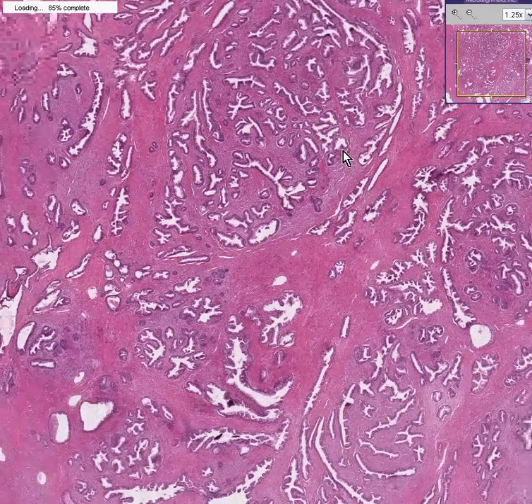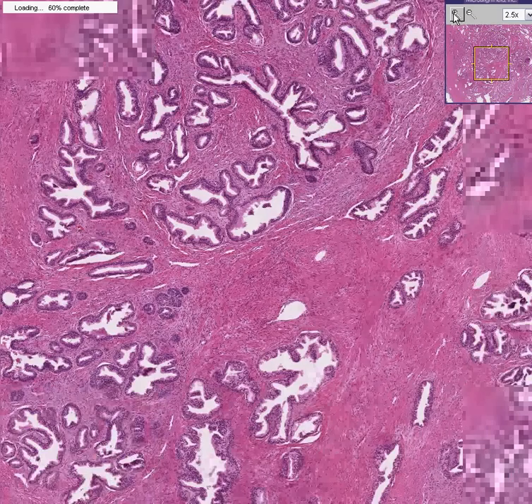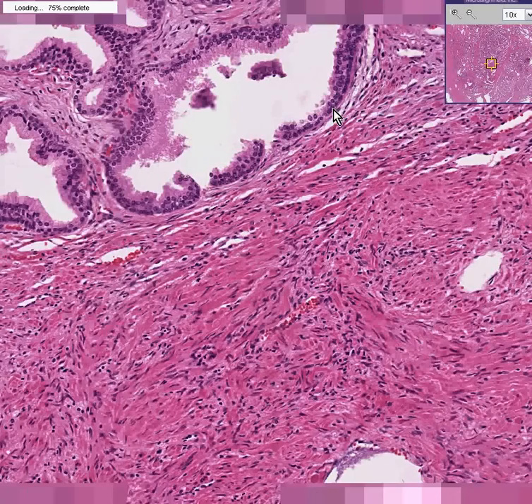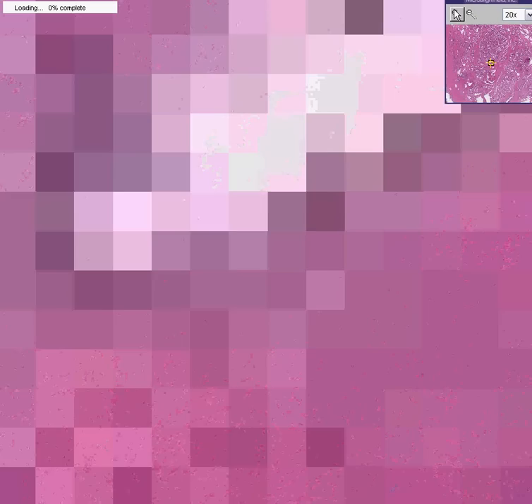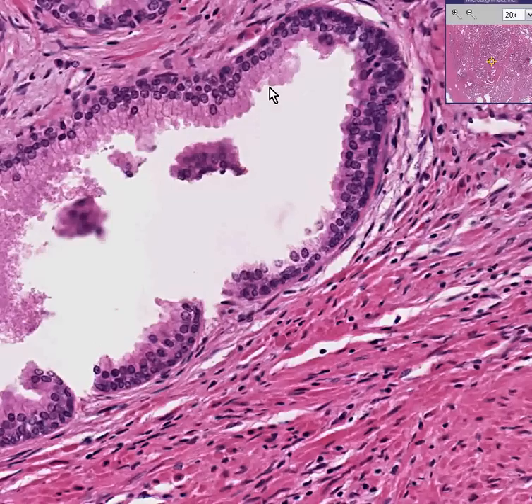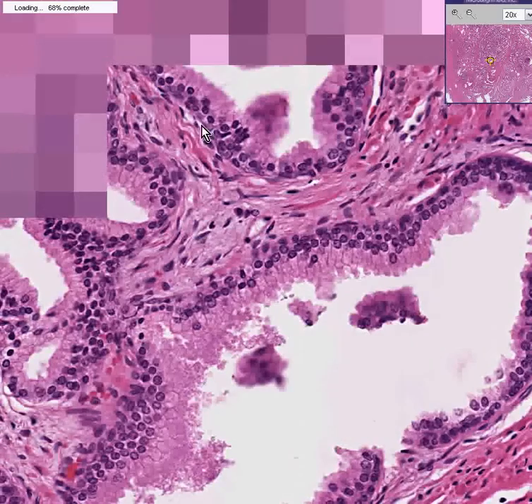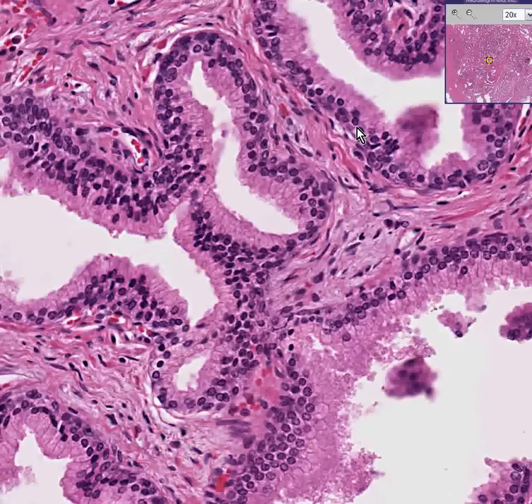Now that we know that the glands are nodular, let's see if they're malignant. And we'll go to 3 or 4 areas, but in real life, we might go to all the areas just to make sure. Notice that the cells of the glands have their nuclei, which are uniform, small, round, non-nucleolated, and are arranged at the base of the gland, whereas the more cytoplasm is towards the apical surface. That has all the features of totally benign prostate glands, even though overall some of them do look like they're arranged in these irregular nodules.